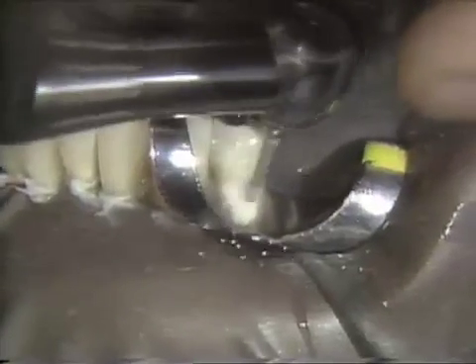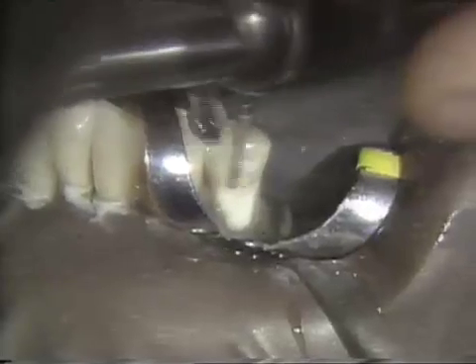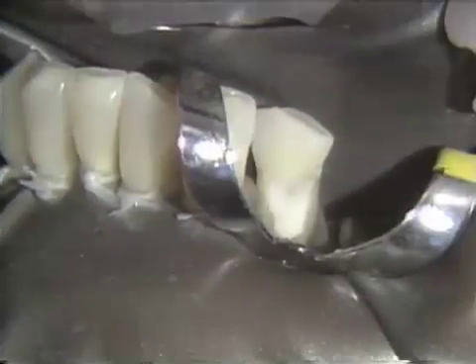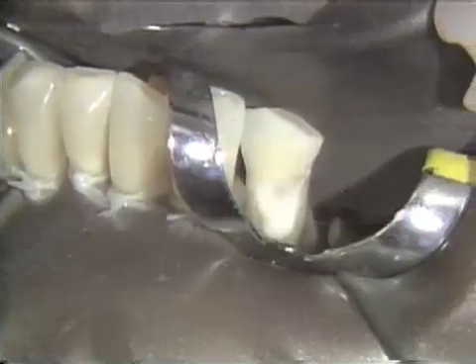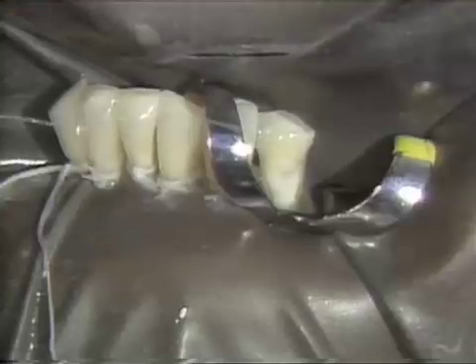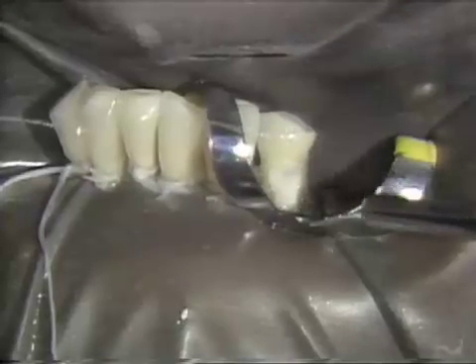For better bonding, the surface of all enamel to be bonded is slightly roughened with a diamond, since enamel under the surface has less fluoride content and better rod configuration. After the enamel has been etched for 60 seconds and the glass ionomer for 15 seconds, and thoroughly rinsed and dried, a frosty appearance is noted on the enamel and glass ionomer. A dentinal bonding agent is applied and thinned with air, then cured for 15 seconds.